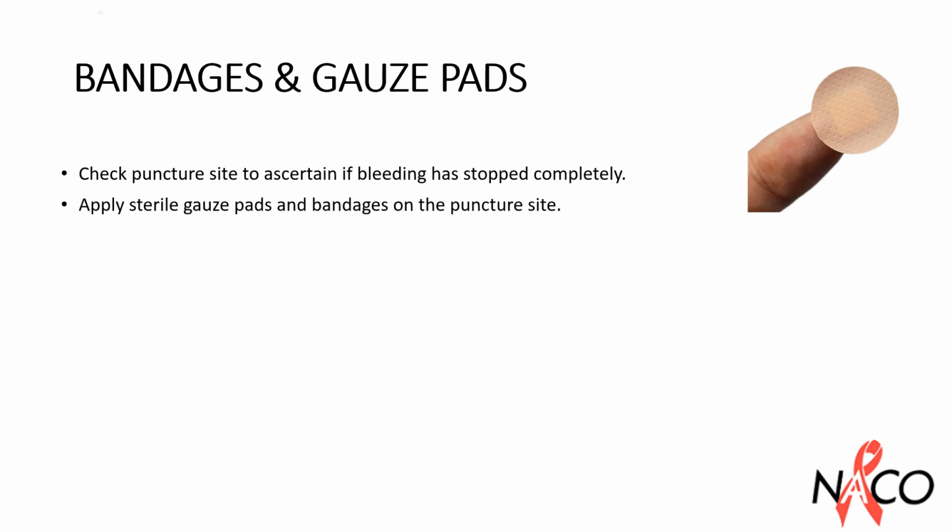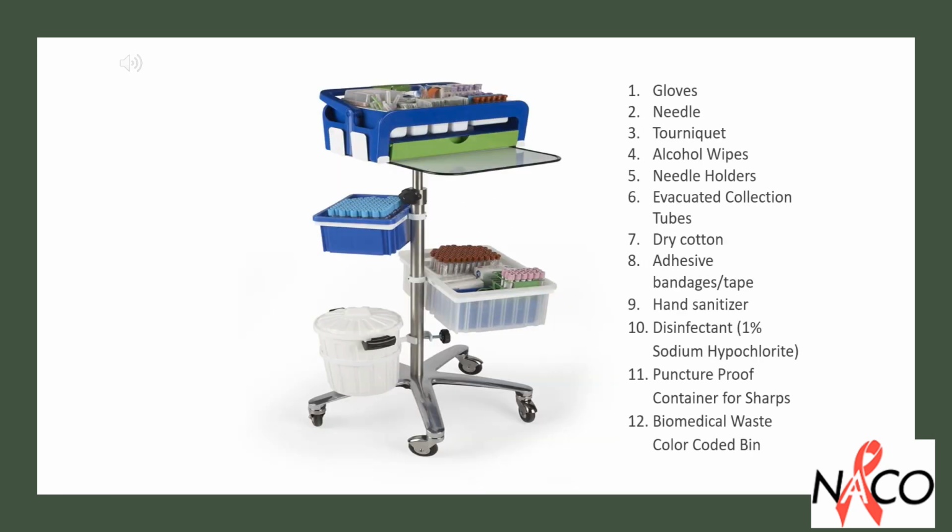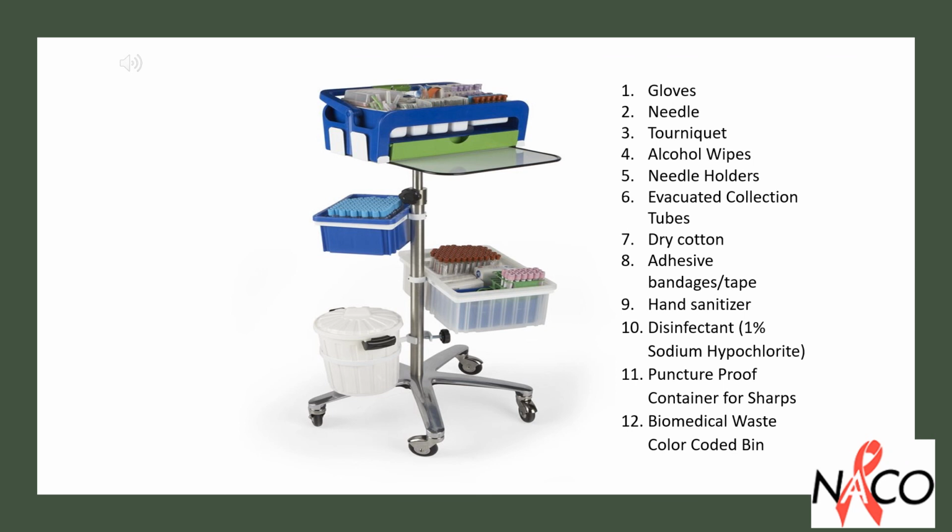Bandages and gauze pads. Check the puncture site to ascertain if bleeding has stopped completely. Apply sterile gauze pads or bandages on the puncture site. Thus, before starting with venipuncture in a patient, always ensure that all the phlebotomy supplies we discussed are ready for your use at one place.